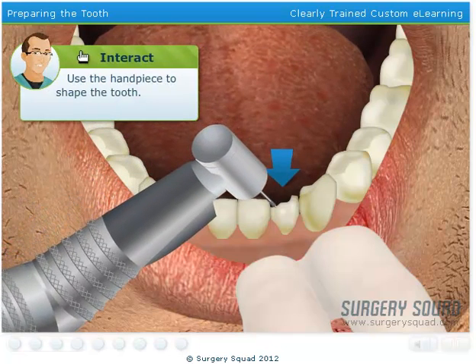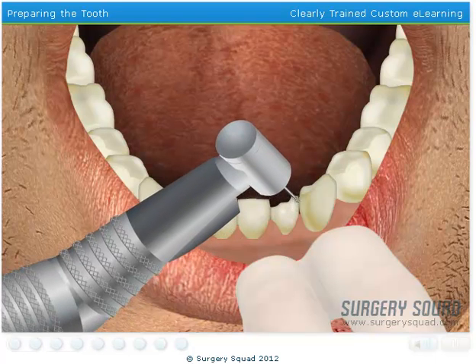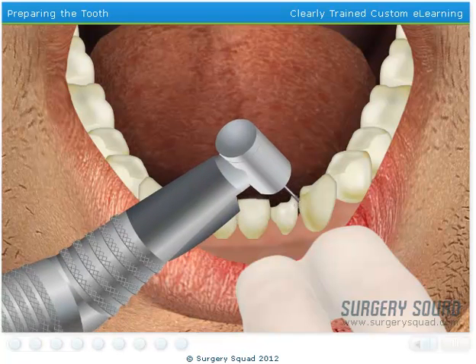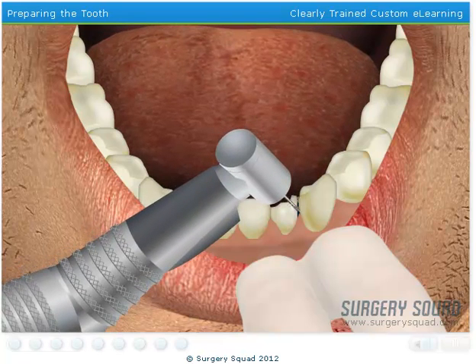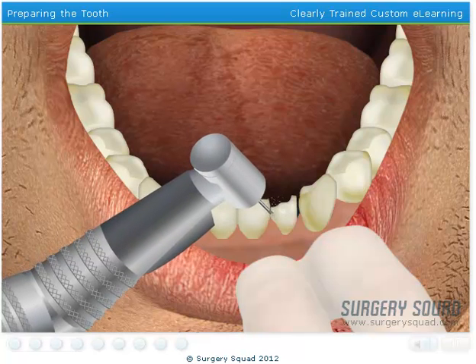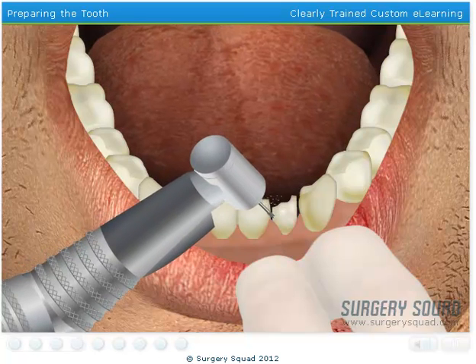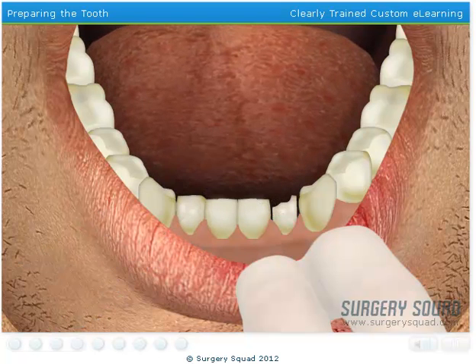Go ahead, give it a try. It looks good, but we need to create a more tapered top to the tooth. This will allow for a more comfortable and exact fit for both the temporary and permanent crowns.